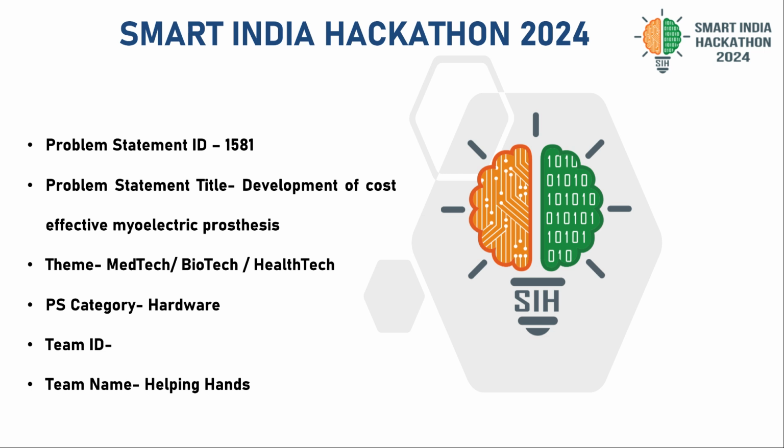The important feature of this prosthesis should be its grasping pattern, and it should be able to perform a large number of grasping patterns, and it should also be cheaper. The problem with the existing solutions is that they are all expensive, and when it becomes high end, it becomes challenging for the patients to operate it, and the features are also sometimes limited and don't work precisely. So what do they expect from us?